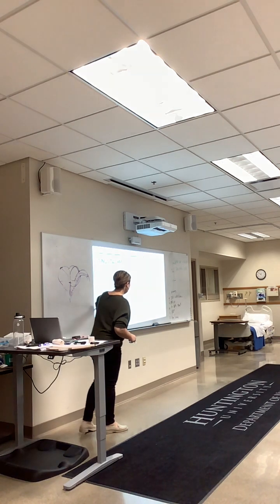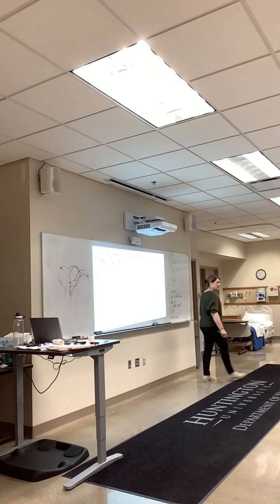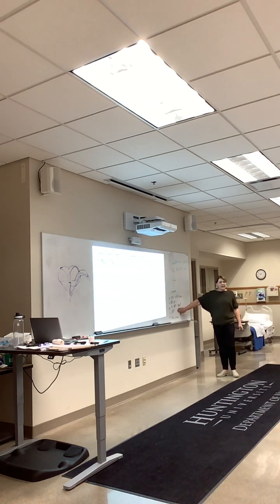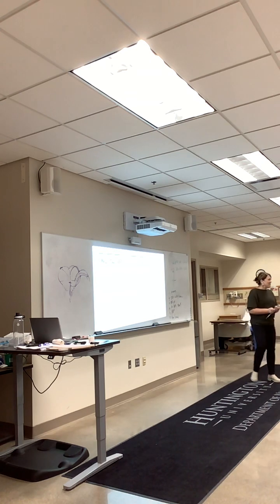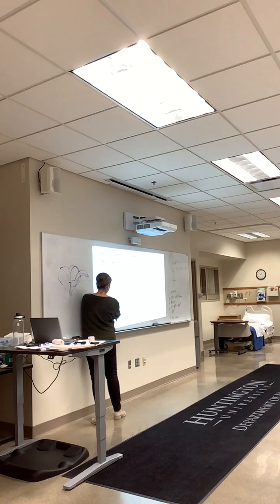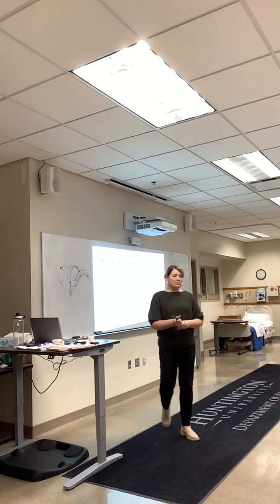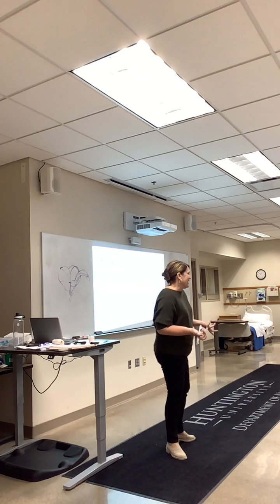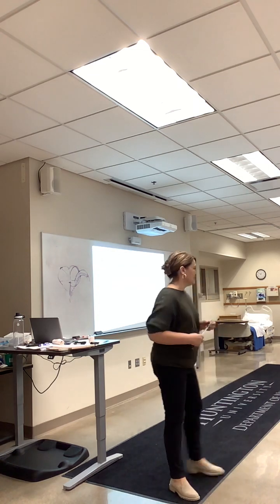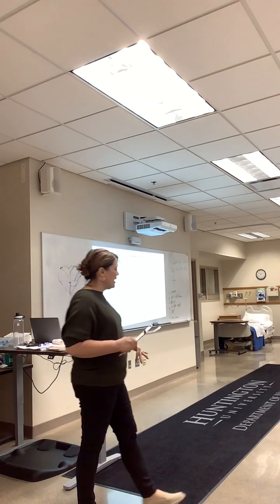Now I'm going to look at my rates. 1, 2, 3, 4, 5, 6, 7, 8, 9, 10, 11, 12, 13. So what's my heart rate? 130, absolutely. So everything looks normal except for my rate. Now that it's 130, I want to make sure it's even. From here to here, is that the same? Yeah, it's the same. And so my rate is regular. So this would put me in the range of sinus tach. So those are your 3 easy ones: normal sinus rhythm, sinus brady, and sinus tach. One's lower, one's higher.